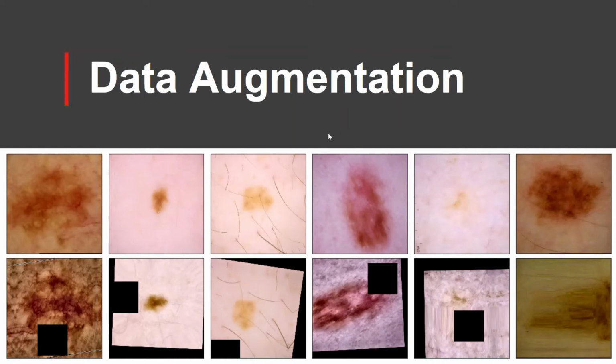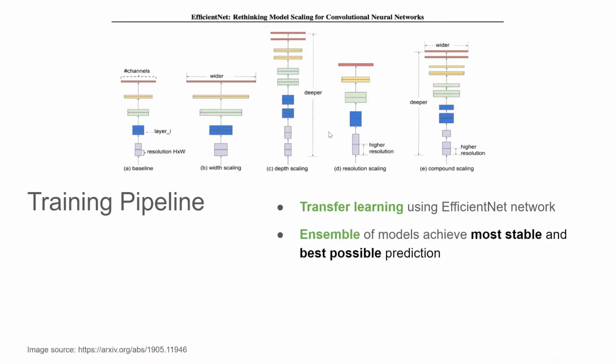Now let's move on to the modeling part. Identifying skin cancer from skin lesion images is challenging for any dermatologist and even more for any network because of its complexity and granularity. We have adopted an ensemble technique to do the transfer learning on our datasets. Now let's move on to the live demo.